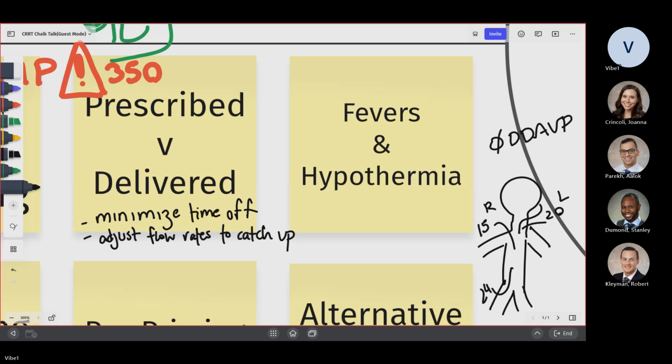You are absolutely right. Subclavian has two issues. Number one, the long-term dialysis. Number two is the bleeding. You won't be able to find it easily and it's very hard to control. So that's why, anytime you're thinking the patient is coagulopathic or has very high BUNs, go ahead and use a groin.